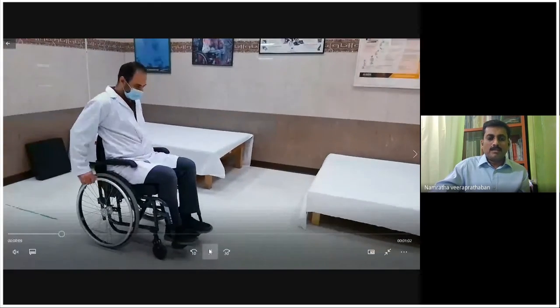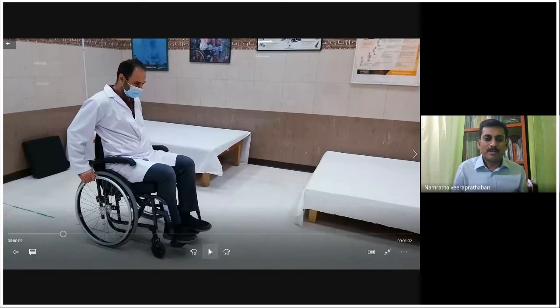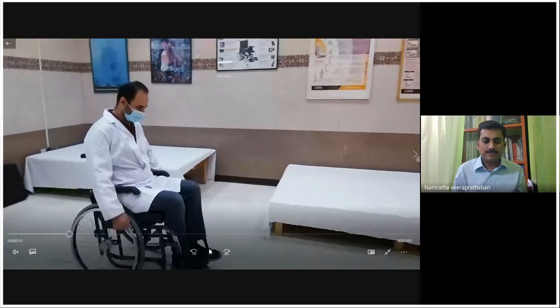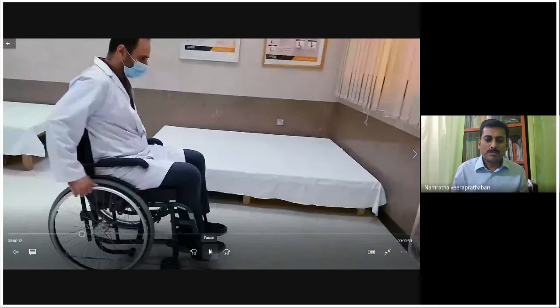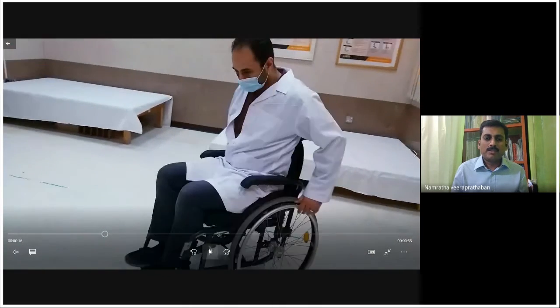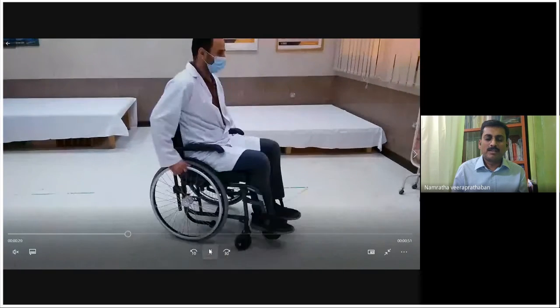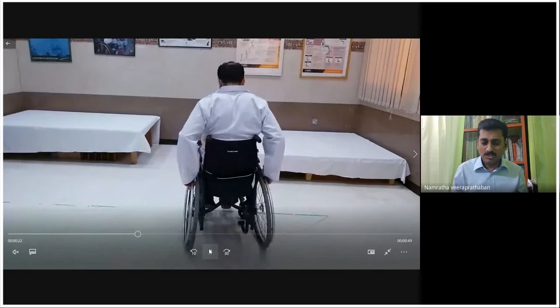Okay, this is how we give training to the patients who come to our clinic, especially those who are admitted inpatients, for example, spinal cord injury patients, how we teach the wheelchair skills. All right, let's watch a few videos. This is an active foldable wheelchair. Initially, this is how we train the patients: how to move forward, how to move backward, how to move left and right. All this orientation we used to teach them.